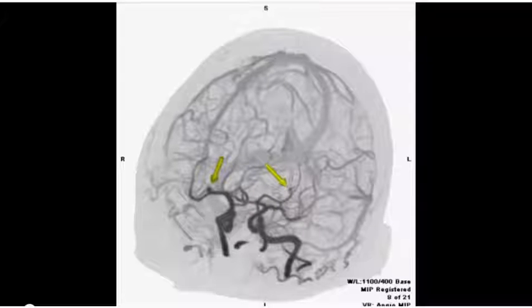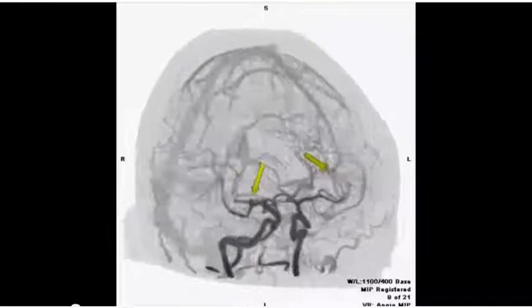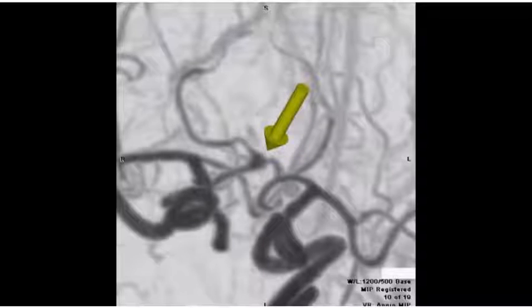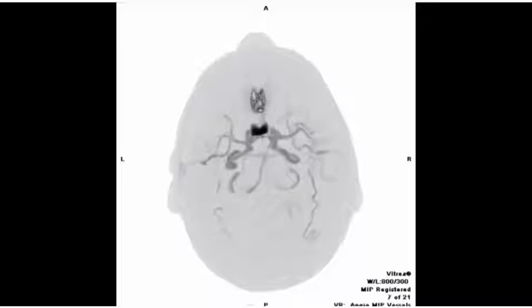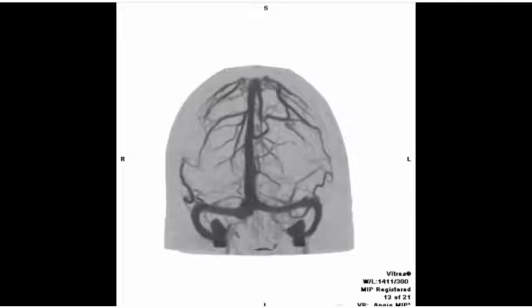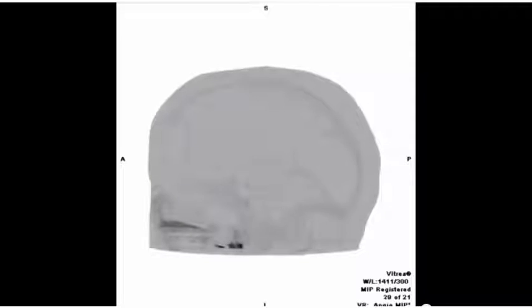The dimensions of this voxel depend on the length and width of the detectors. We use Hounsfield units, or HU, to determine the contrast of color of every structure. This Hounsfield unit takes the water attenuation coefficient as a reference to obtain the contrast of all other structures. The reason for this is because the body contains a large amount of water, and every structure has an attenuation coefficient in relation to that of the water, being water's Hounsfield units value 0.